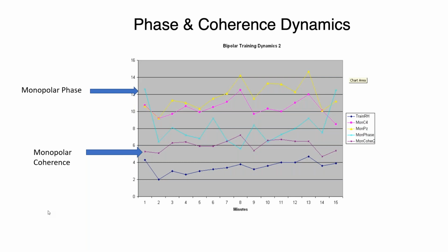I have the maps on all this. And I did the same thing with photic stimulation. We would run different people, different frequencies of photic stimulation, record the maps, break them down, analyze different segments of the session, and then compare it to their base brain map, and then compare it to when they're training. You do that and you get some good information about what's going on.